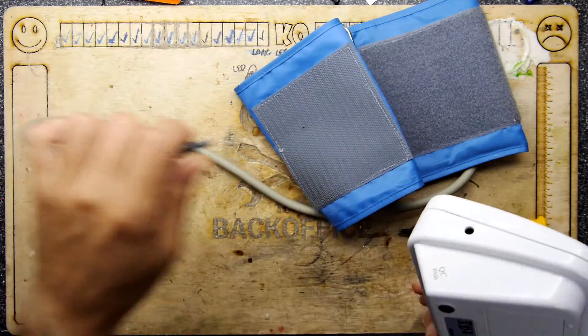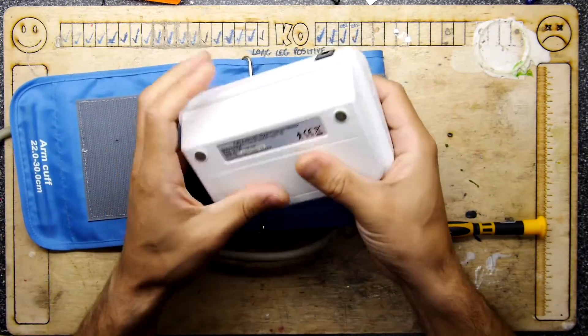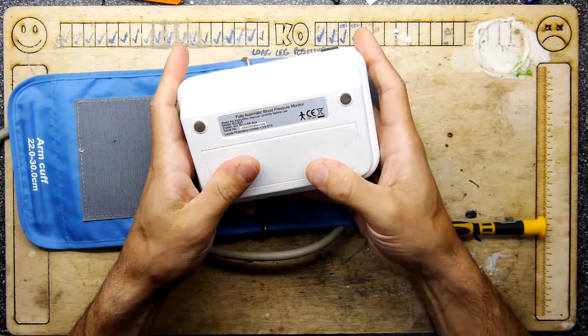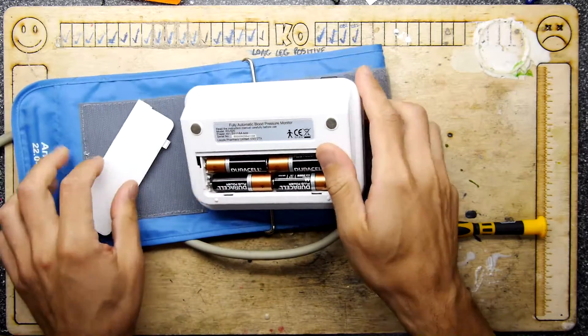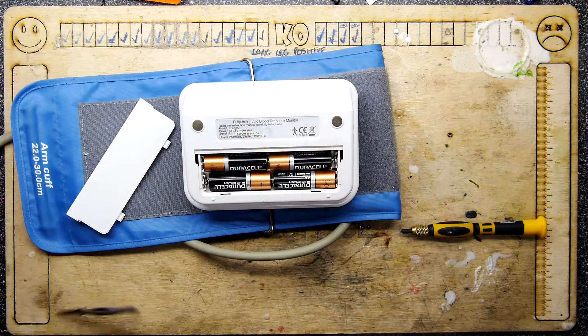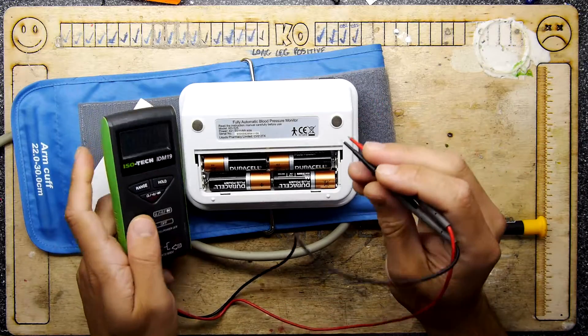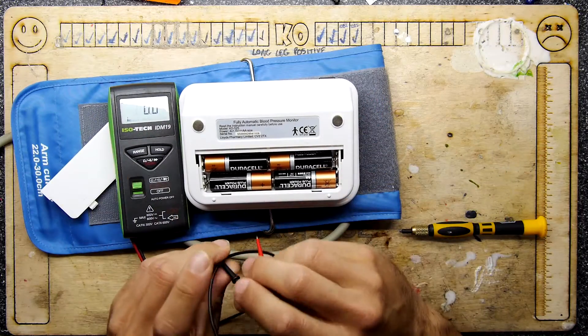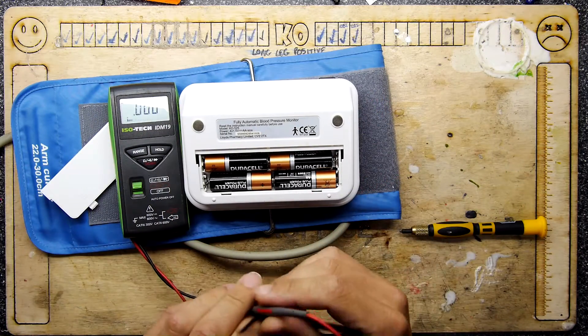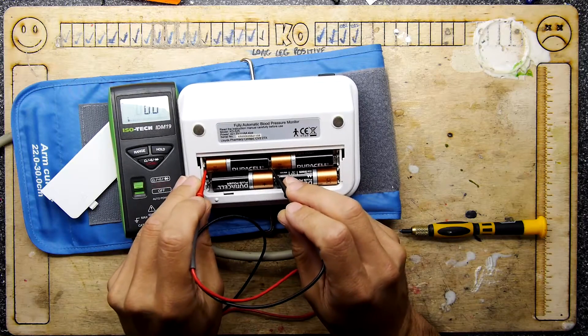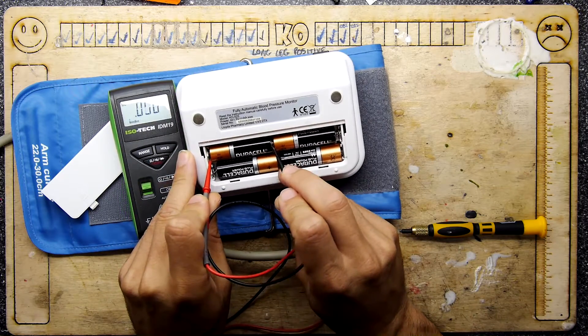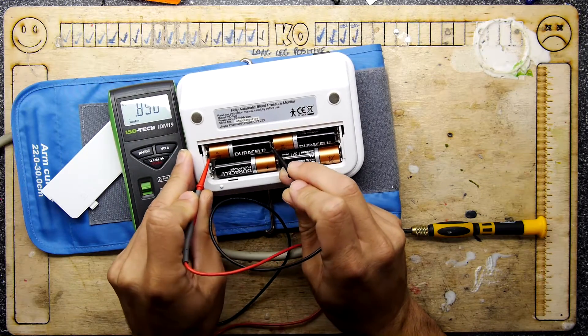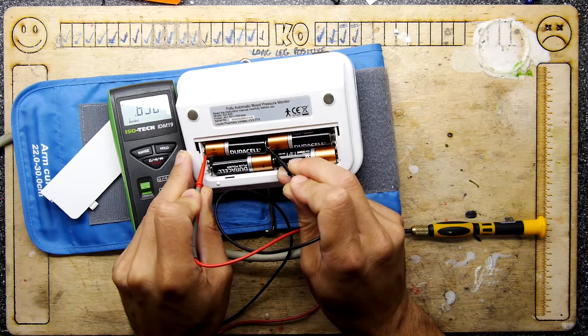Crikey what is happening with me? But it's very early in the morning. I will give myself that concession. As far as I'm aware it just doesn't work and these might even be new batteries. I'm just going to check the old battery cell in here. 0.8 volts.